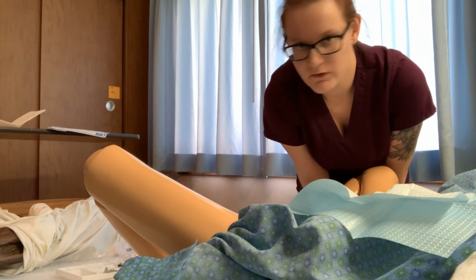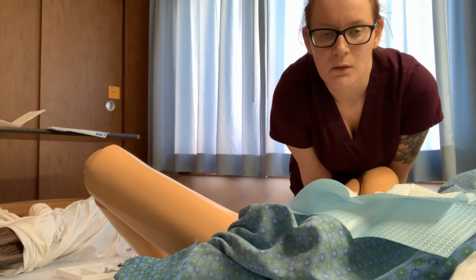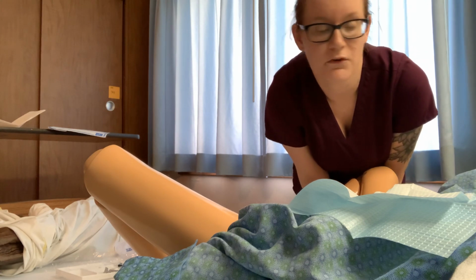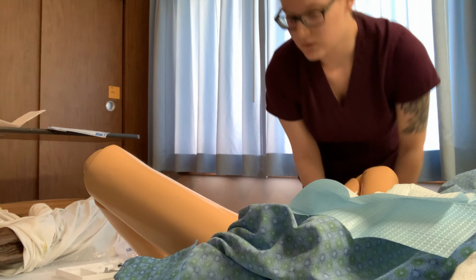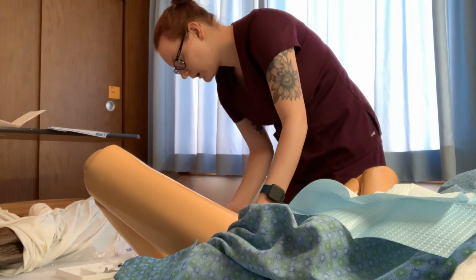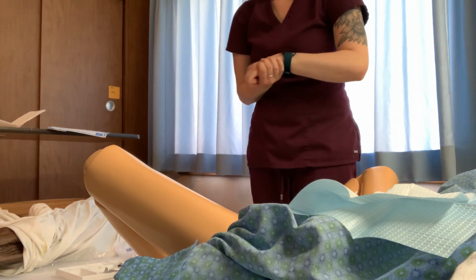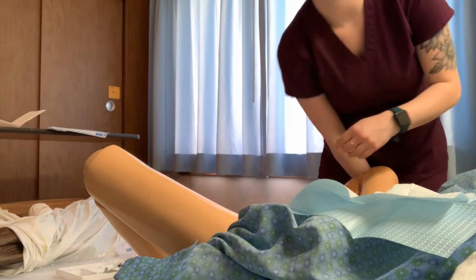For males, you definitely want them to breathe in and breathe out before putting it in and taking it out. It's a little bit more uncomfortable for males than it is for females. So you'll get it all cleaned up and cover the resident back up, lower the bed, and make sure they have their call light.